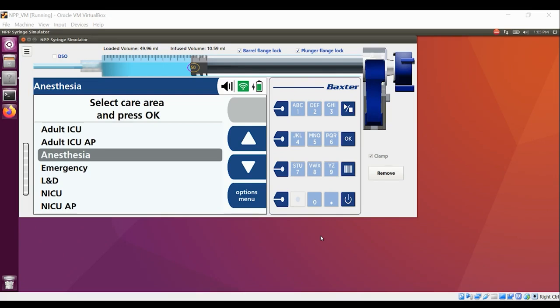Because of that, they need flexibility to be able to enter specific parameters for dosing as well as weight basing. Some of the things that your anesthesiologists are concerned about when they're choosing a syringe pump is accuracy. That's one of the reasons that they use a syringe pump for most of their continuous infusions in the anesthesia department.